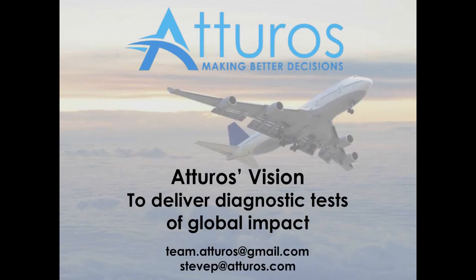Is the test specific to prostate cancer? Have you tested it against other cancers? Again, that's an interesting question, and it's one that we've given significant consideration to, because what the test isn't is a test that's used for the diagnosis of prostate cancer. It's a test that's used subsequent to a gold standard diagnosis of prostate cancer, which is a tissue biopsy.